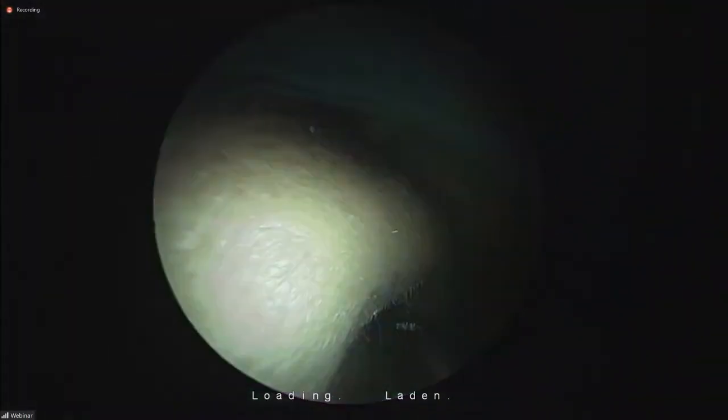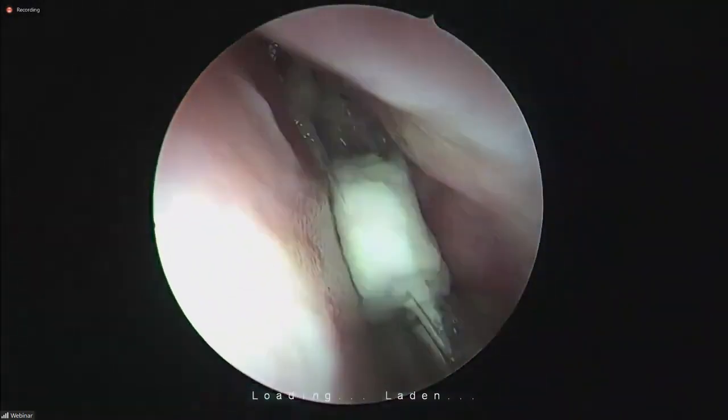Hello? Yes, sir. Are you getting the endoscopic picture? Yes, sir. Yes.